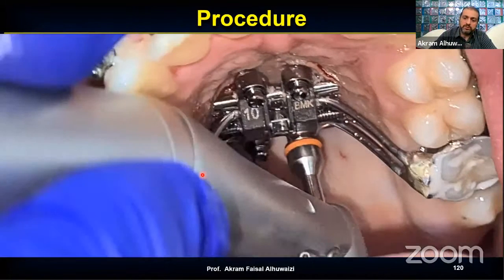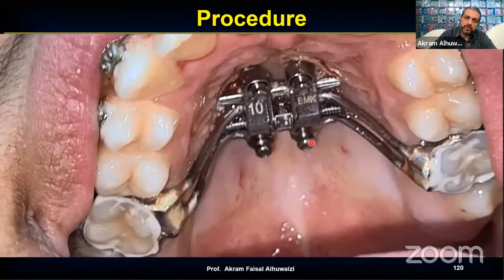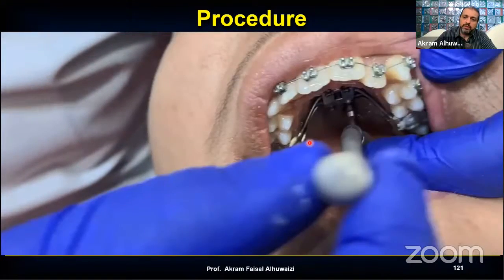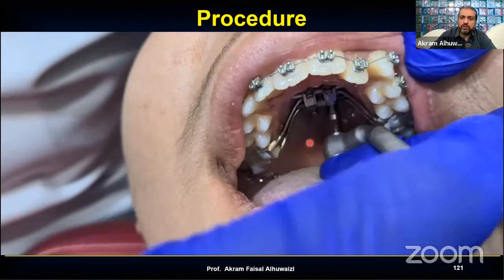I don't like to finish off with the handpiece, because when you're finishing off with the handpiece, you have no tactile sensation of the bicortical engagement. I have no idea if I had bicortical engagement. So nowadays, I prefer to do the ratchet like this one. But even with the ratchet, it's so lengthy if you do it in full.